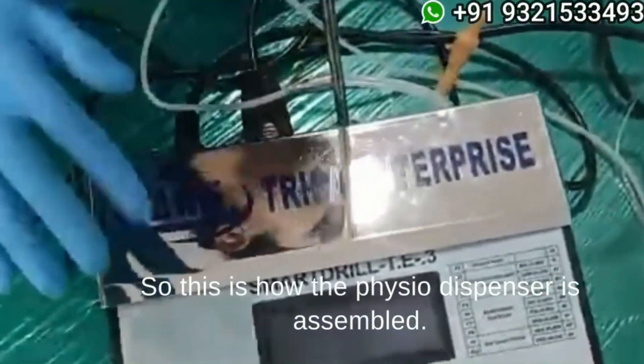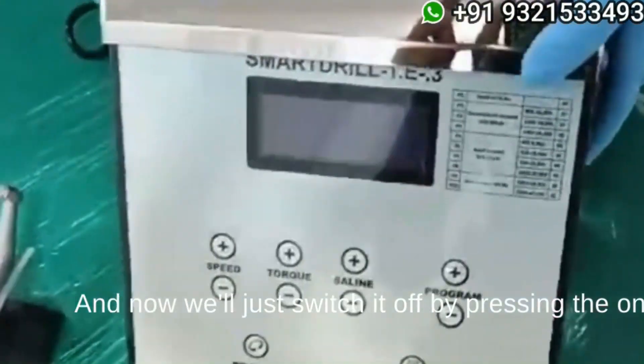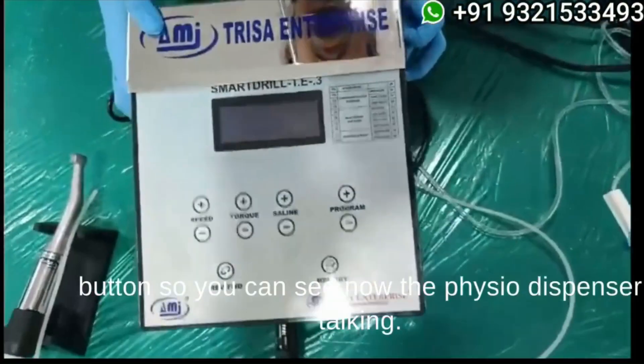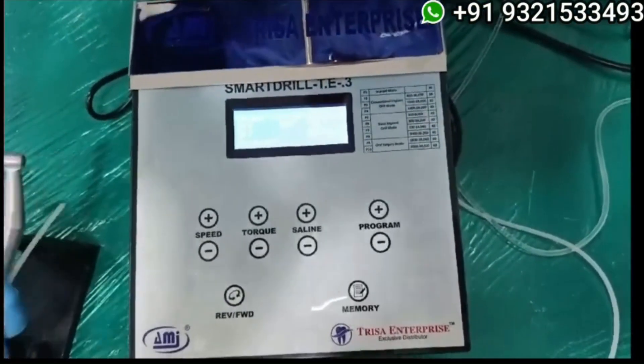This is how the physiodispenser is assembled. Now we will just switch it on by pressing the on button. You can see the physiodispenser is now working.